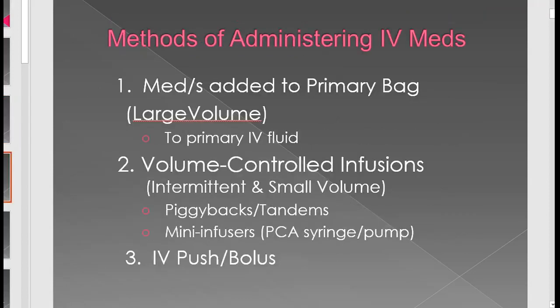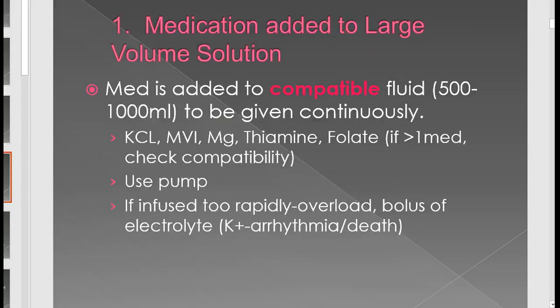There are different ways to administer IV medications, either through a large volume, which is what we call a primary bag, intermittent or small volume, which is known as piggybacks, for example, antibiotics, tandems, which I will describe later, mini infusers, which is like a PCA pump, and IV push and bolus. Medications can be added that are compatible to primary bags, and this usually consists of 500 to 1,000 ml bags, and it's given continuously. We always use a pump.